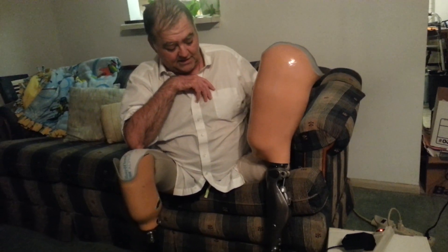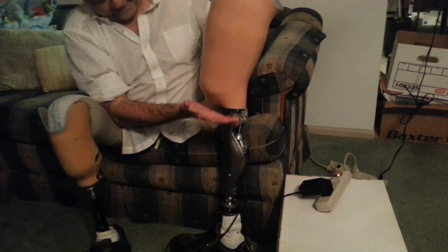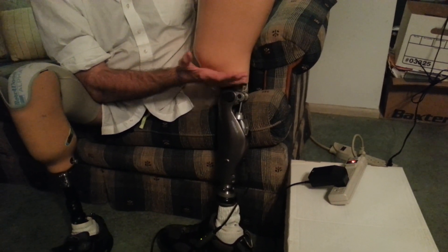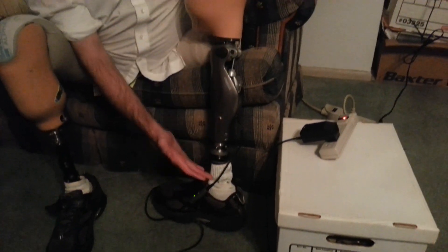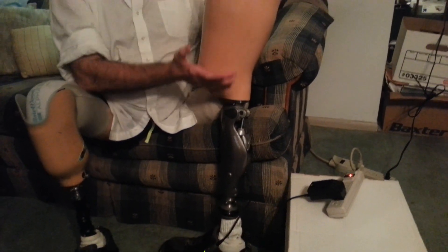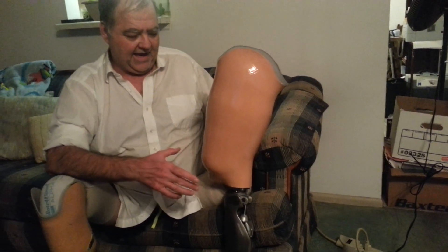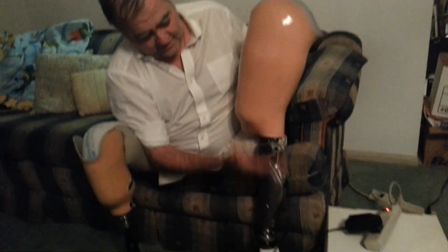The C-Leg 4 refers to the part from basically the knee — the knee portion down to the foot. So this part right here is the C-Leg 4. The foot can be any number of different feet, and the socket can be any number of different sockets. So if you see a leg that looks different than this, it's this part that counts.